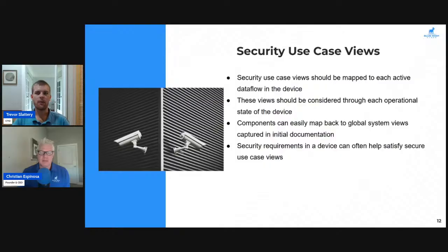So doing something like a CRC or a hash of a bit of information to verify that it has not been modified, and checking that hash on both ends can be a great way to verify that we have an intact bit of information. For something like DICOM, we can try stripping out certain functionality and verifying that it's still a DICOM image. It hasn't been ported over to an executable, which is weirdly a possible thing with that image file, to turn it into an executable.